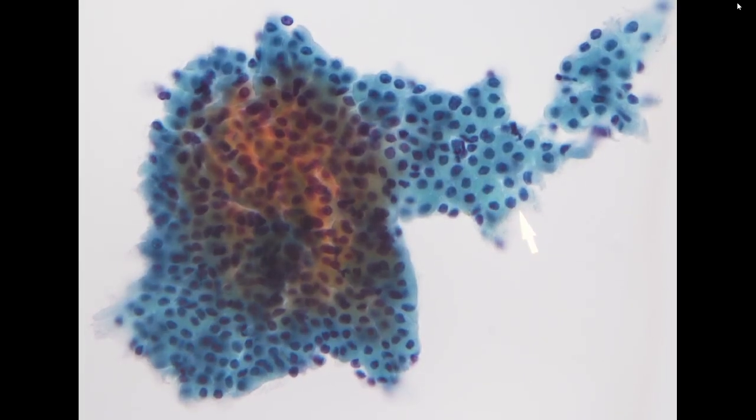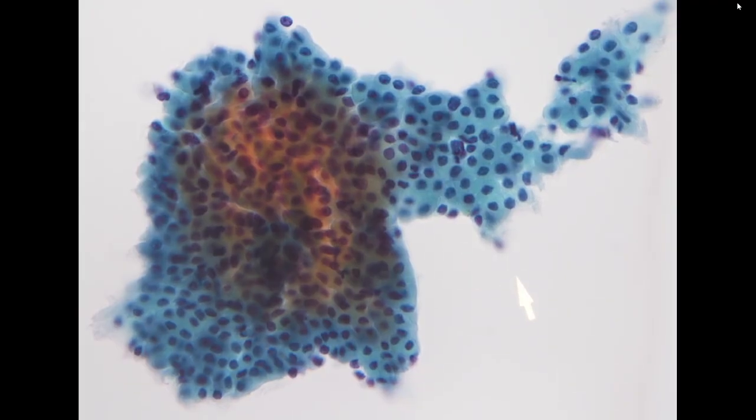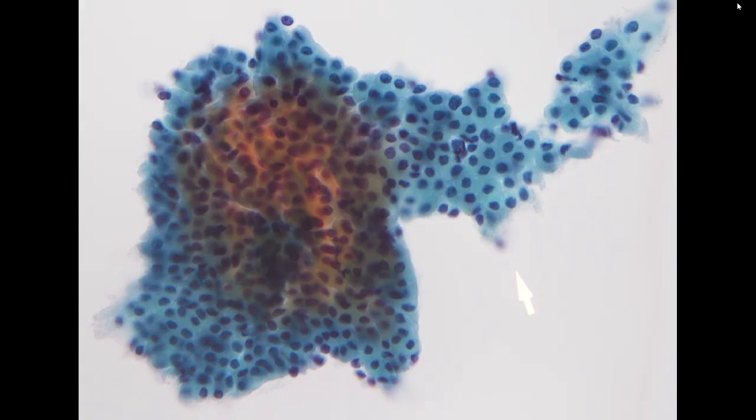The cytoplasm is dense and granular, with a cyanophilic color at the periphery of the cluster, but oftentimes in the center it will have a little bit of orange color inside. So this is oncocyte. This is benign oncocyte with perfect monolayer sheet with great honeycombing arrangement.